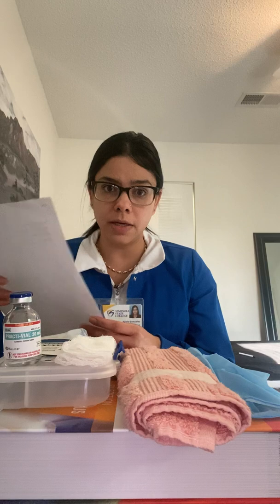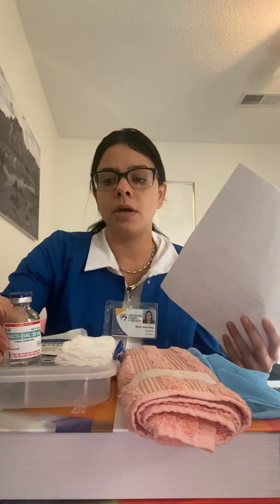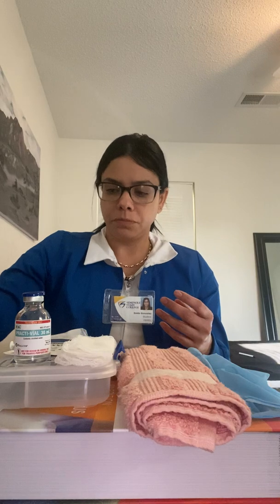After that, if I need to make any calculation, I would do it at this moment. For this particular medication, I don't need to do any calculation. The order is very clear. It's 0.5 ml that I'm going to be drawing from the vial right here. So I don't need to do any calculation.